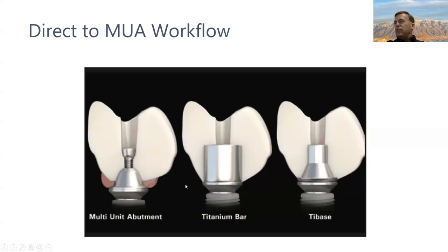The other thing that's nice is that these eat up material space. So I can generally make this kind of restoration a little bit slimmer because I don't need to allow for this. I'm also getting rid of a potential complication because I can't have cement failure here when there's no cement to fail.